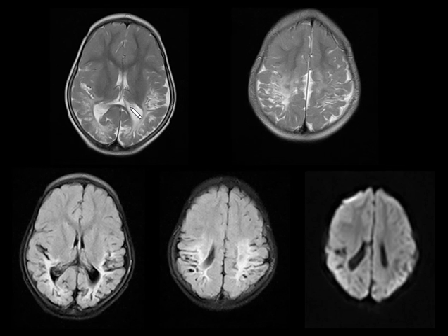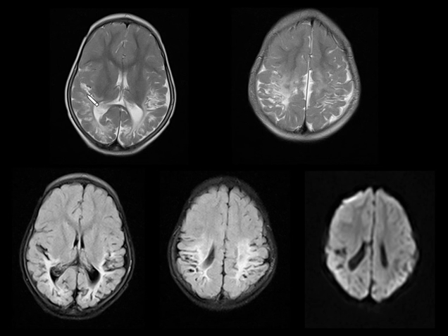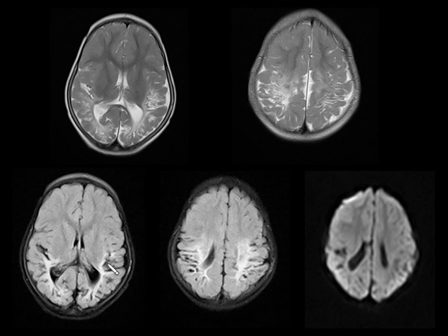Coming to the next case — a child with perinatal history of hypoxia and delayed cry after birth. You can see symmetrical hyperintensities in the periventricular location in the peritrigonooccipital lobes with mild asymmetrical dilatation of the atria of the lateral ventricles. These are gliosis in the periventricular location — periventricular leukomalacia in a case of HIE (hypoxic ischemic encephalopathy).